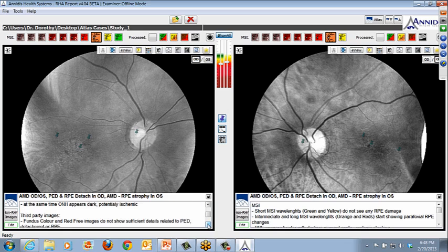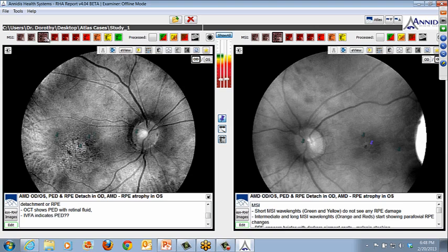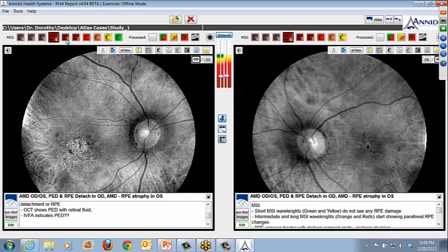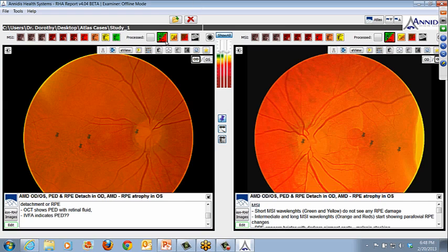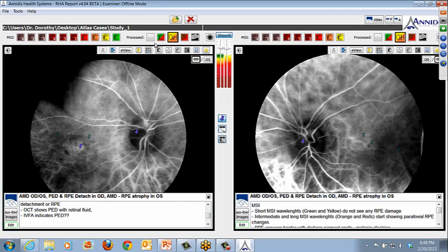It's a long description of exactly what you're seeing through each one of the spectral slices. So you can read that, you can click through the spectral slices, and you'll get some information about what you're looking at. In this case, for example, the optic nerve head is noticeably dark, with potential for ischemia or hypoperfusion when there's hyporeflectivity on the oxy-deoxy map, for example.